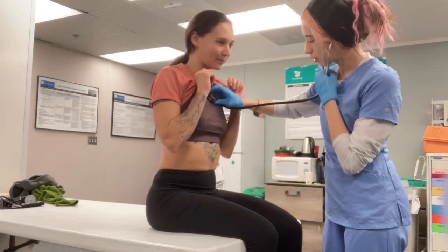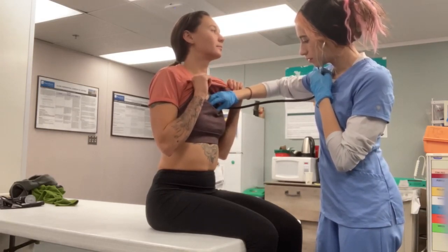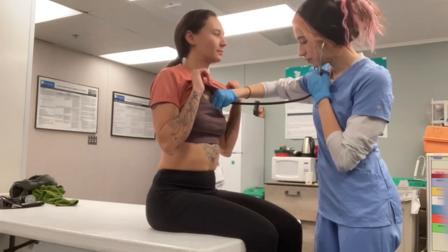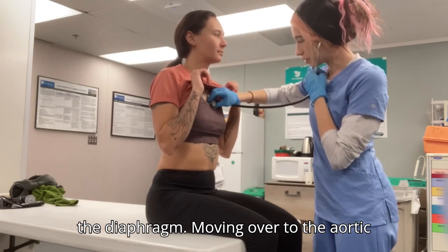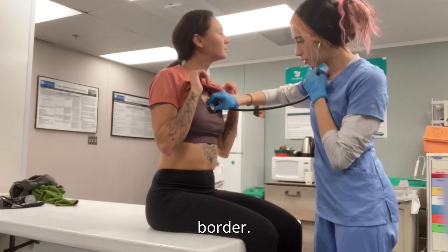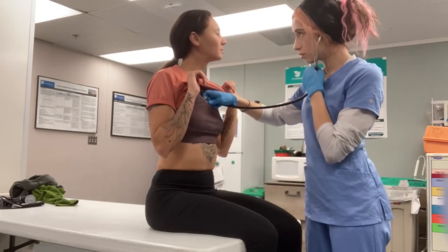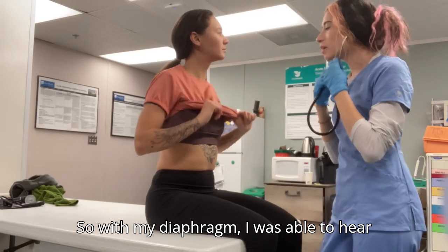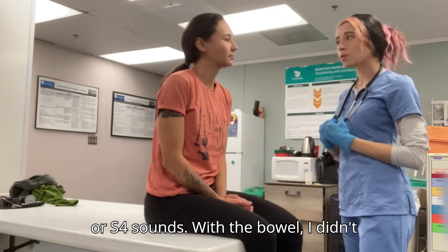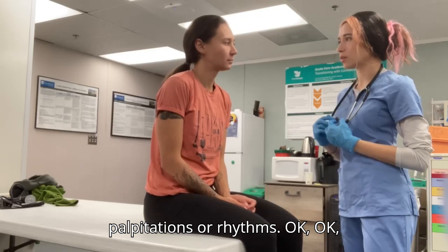Okay, and then I'm just going to go through here, moving up to the pulmonic area. And switching to the diaphragm. And moving over to the aortic area, second intercostal space, right sternal border, and then switching to the bell. So with my diaphragm, I was able to hear S1 and S2 sounds, no S3 or S4 sounds. With the bell, I didn't hear any murmurs or any other abnormal palpitations or rhythms.